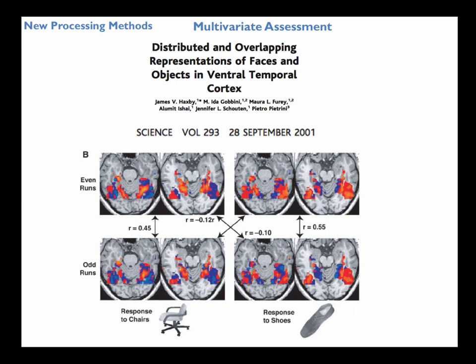And he said, oh, there's a blob that shows an area of activation with faces. And it's different than houses, for instance. But he tried to expand this to find other blobs. He did chairs and scissors and shoes and cats and things like that, and actually realized it was no longer a blob. So this happens to be one typical activation with a chair versus a shoe. It never really becomes clear. It starts to look to the eye like more of a salt and pepper pattern that other researchers might look at and say, oh, the experiment didn't work.